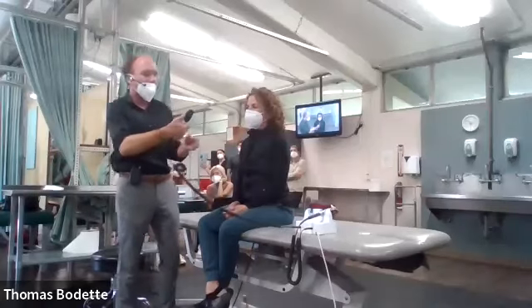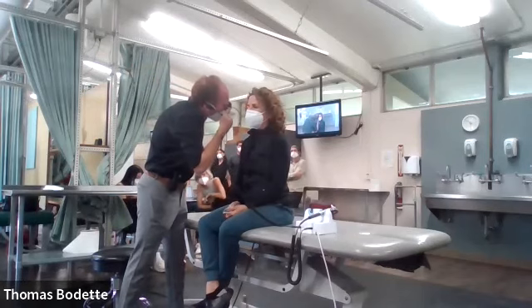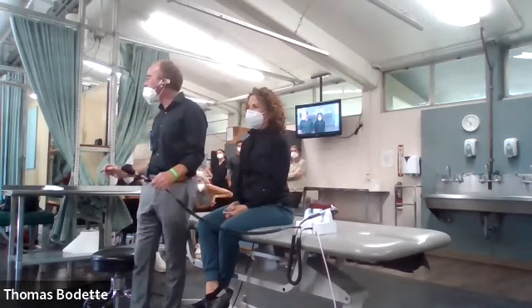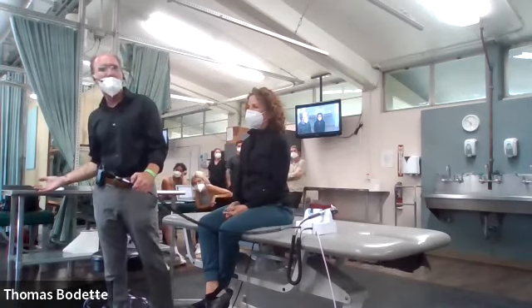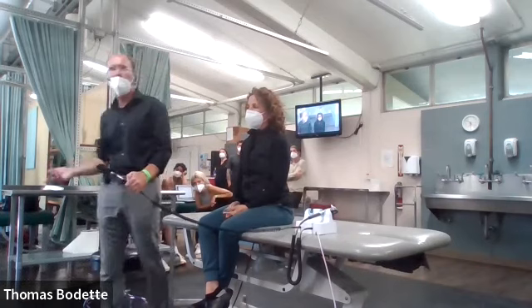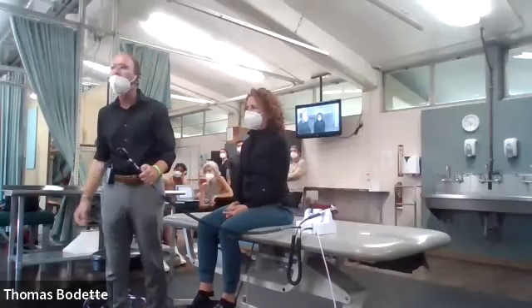Then, last step. You're going to work yourself medial to visualize the macula and the fovea. You might see that yellowish debris coming off the macula. That would be consistent with age-related macular degeneration. You also want to look at the integrity of the retina itself. Is it jagged? Is it irregular? That could be indicative of a retinal detachment. Both of those result in central vision loss just because of their position relative to the optic cup and the optic disc.